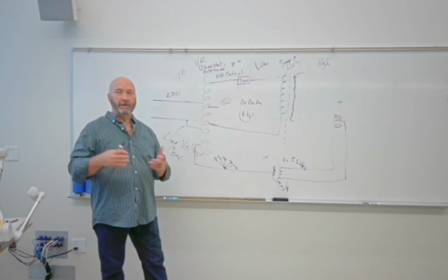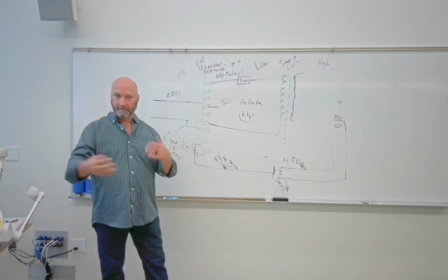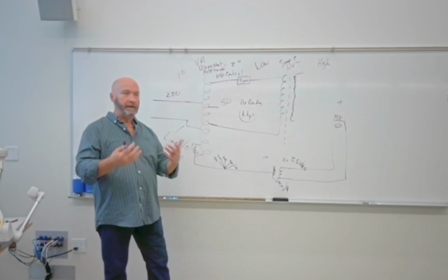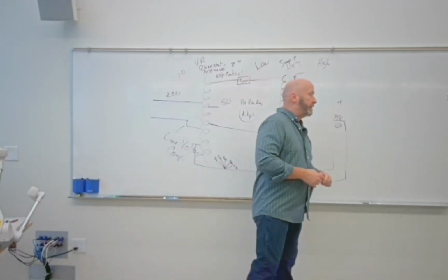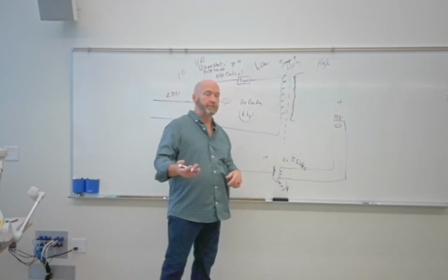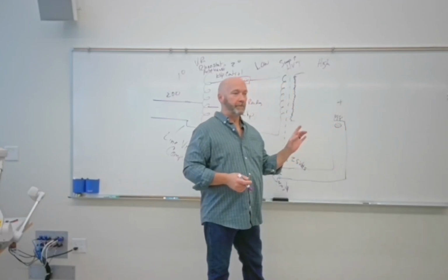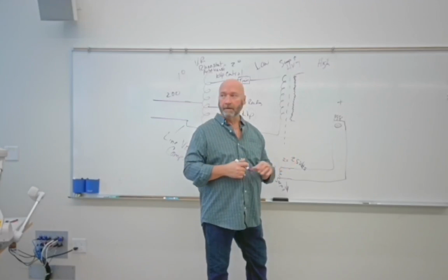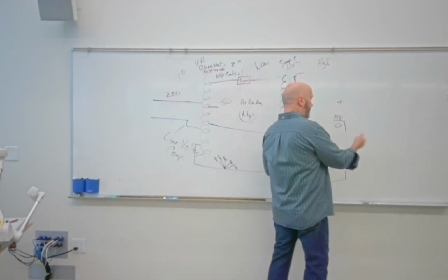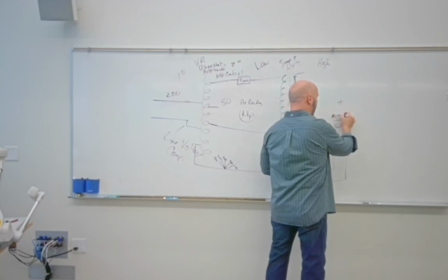So saturation current is kind of that. You can't get enough exposure. You can't get enough mA. You can't get enough current to get an exposure. So what saturation current becomes is, let's say you set a maximum exposure. Your filament is only so big. Did you get a look at the filament whenever the tube came around? It's tiny, right? Little bitty tiny wire. So when we create a space charge, it's going to be limited how many electrons you can actually stack on that thing.